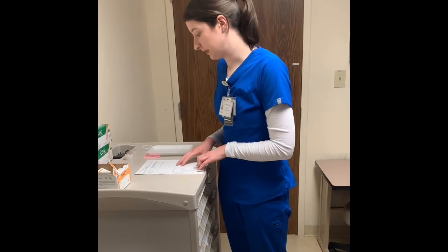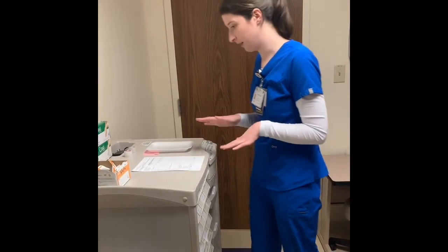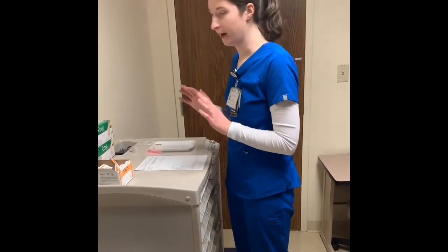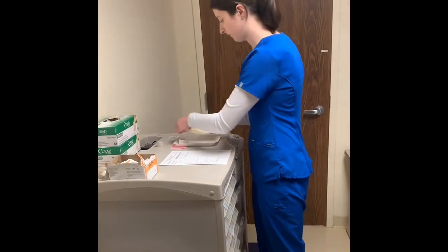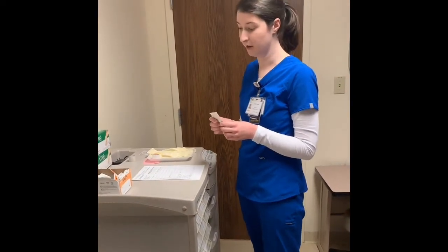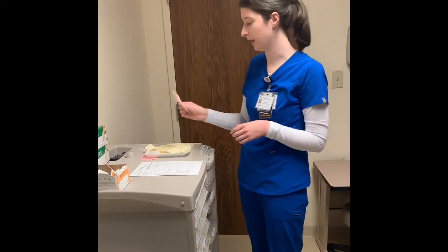The patient's most recent fingerstick blood sugar level was 355, and it is currently 1100. So now I'm going to go ahead and collect all of the supplies that I will be using. So first, my tape, which I will be using to create a medication label later, some clean gloves, some alcohol swabs, which on the box it says that the expiration date for these alcohol swabs is 8/21/2019, so technically these are expired. In a healthcare setting, I would not use these, but for the sake of this situation, I'm going to go ahead and use these alcohol swabs.